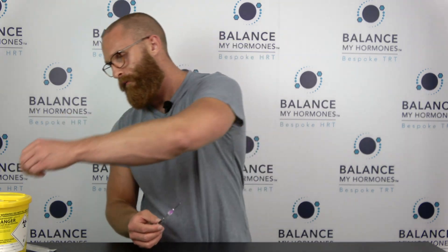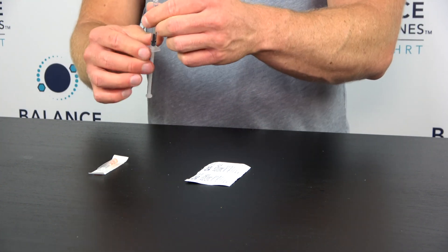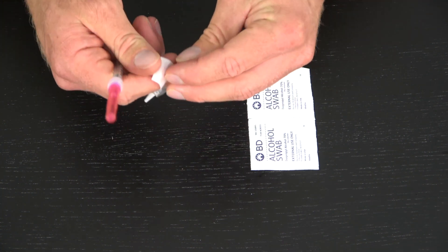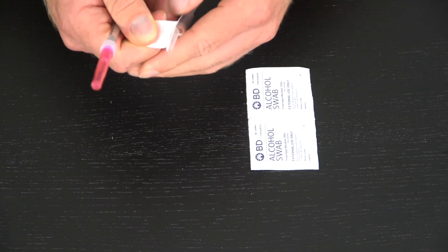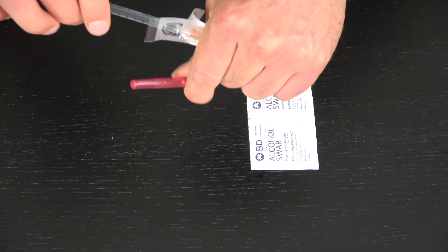I'm going to draw back on the plunger just to draw any oil out from the top. I've got my dosage in there. Now we're going to swap needles — I'm going to take off the filter needle and pop on my injecting needle. There we go — pop the filter needle in the sharps bin.